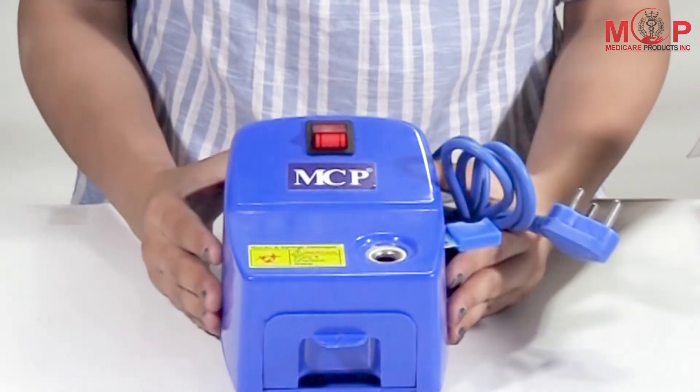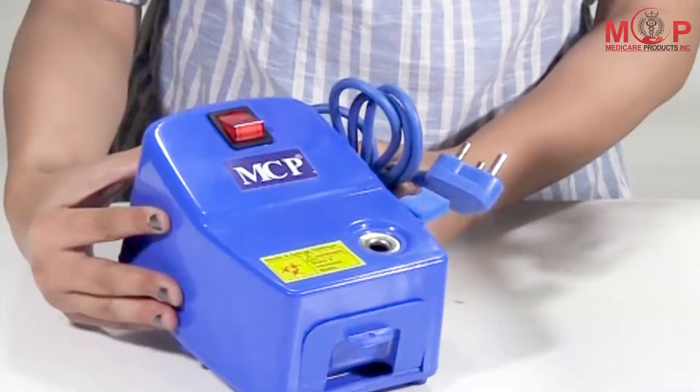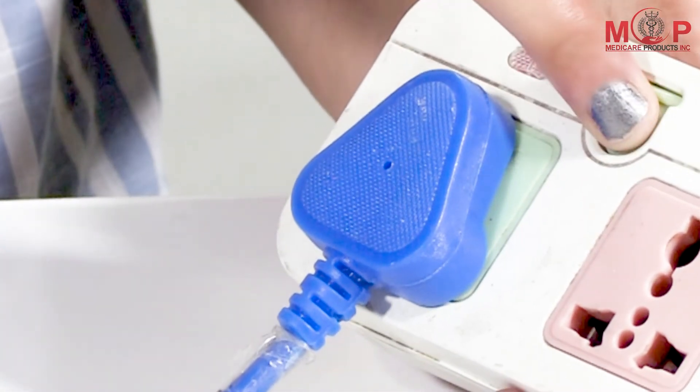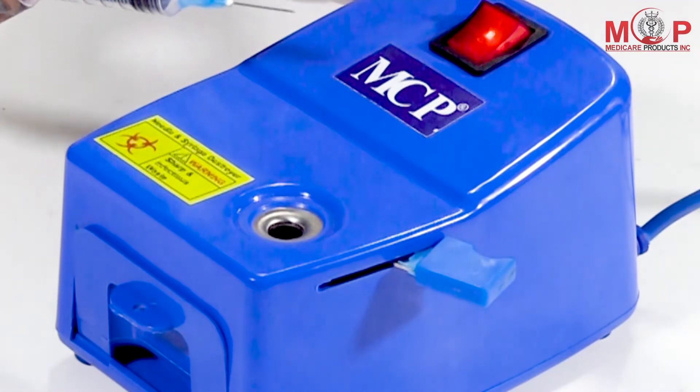It is very easy to use, hygienic, and has no maintenance cost. To terminate the needle, switch on the device and insert the needle in the needle slot.